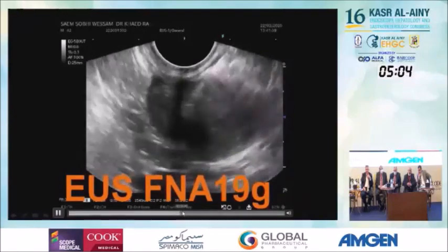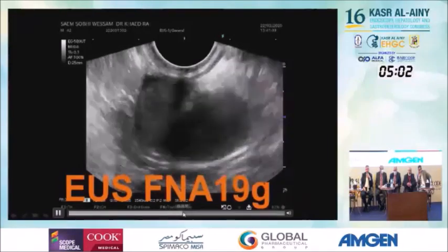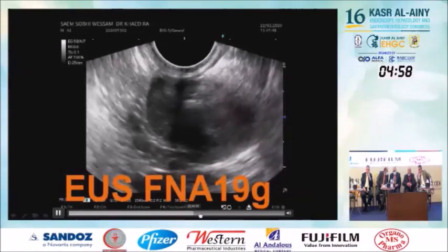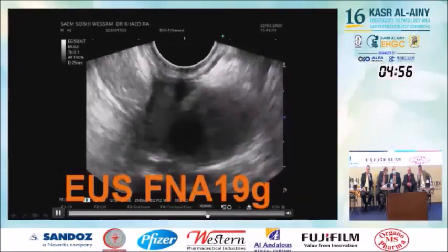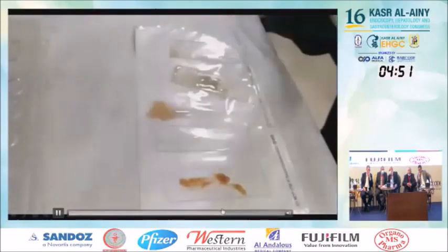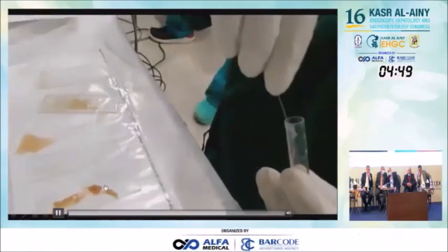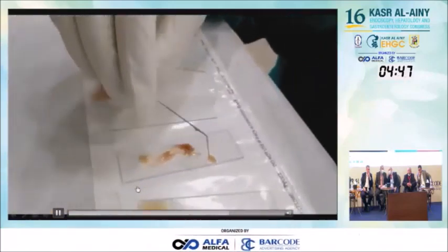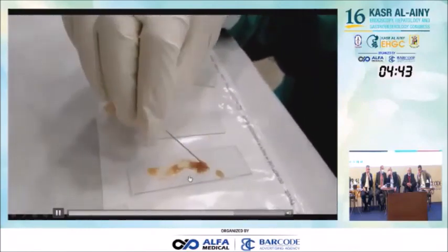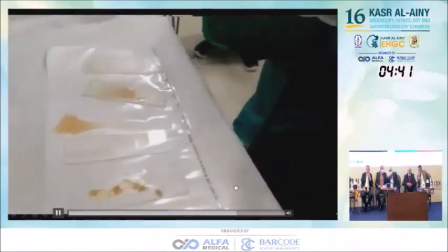I was impressed to see the material which we got from this lesion, a very thick, viscous, proteinaceous material.